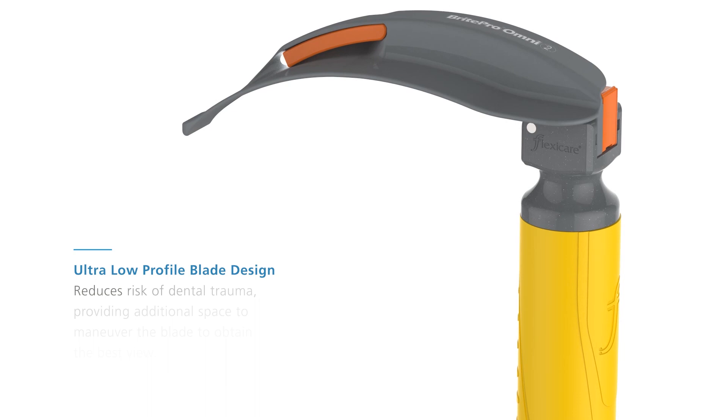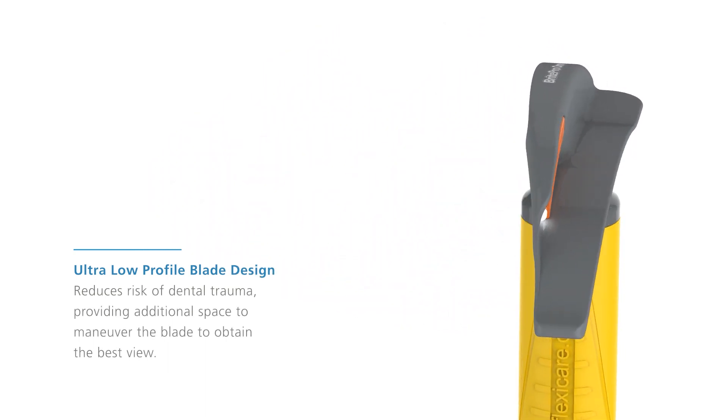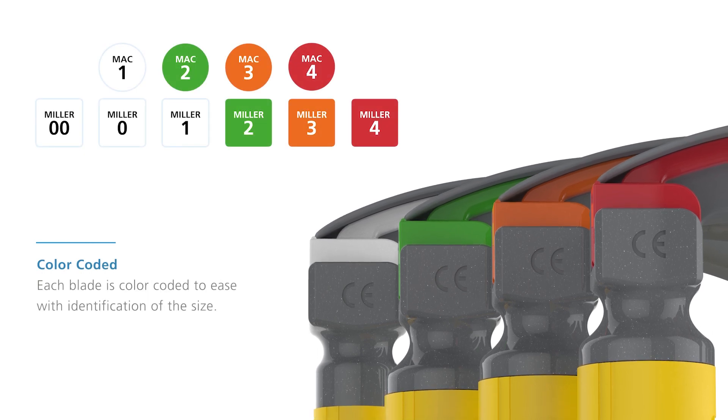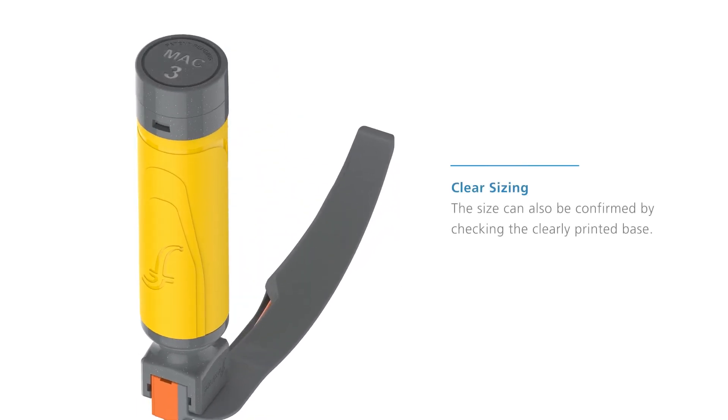FlexiCare's ultra low-profile blade design reduces risk of dental trauma, providing additional space to maneuver the blade to obtain the best view. Each blade is color-coded to ease identification of the size, and the size can also be confirmed by checking the clearly printed base while in use.